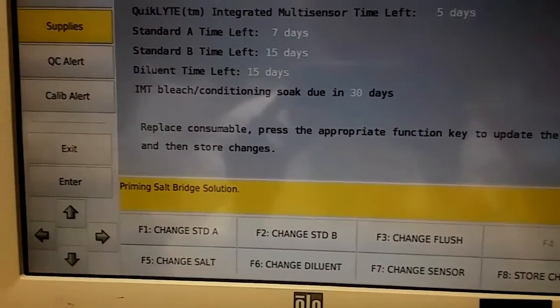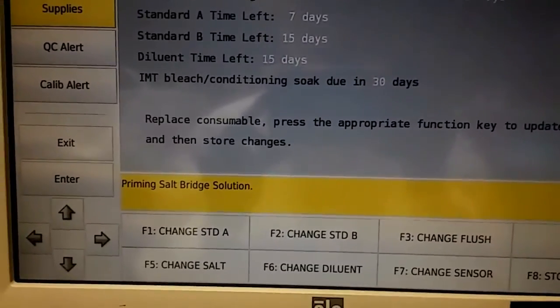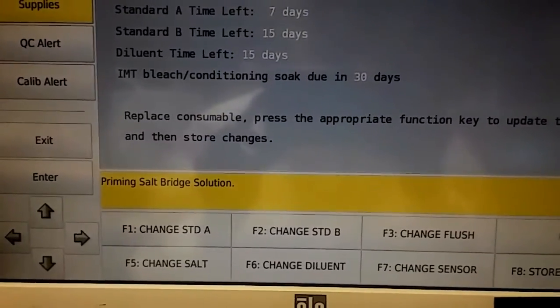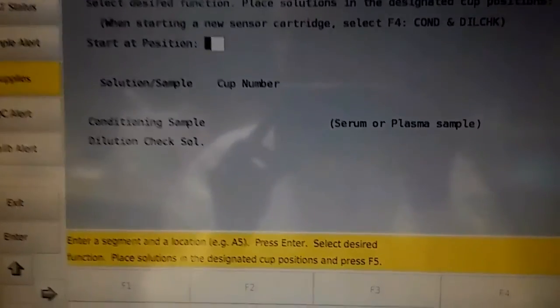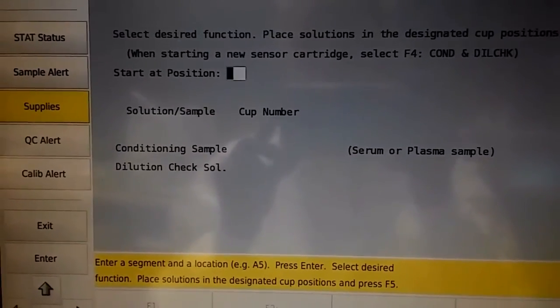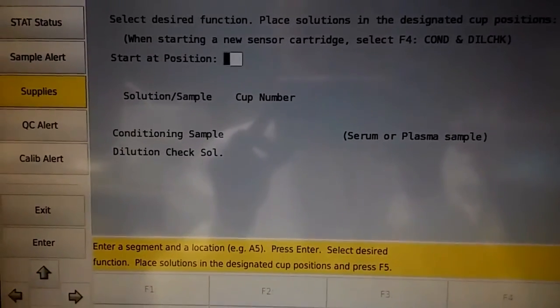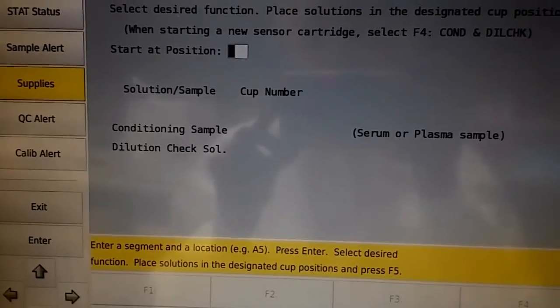Now that the changes have been stored, it'll prime the salt bridge solution — that just takes a few seconds — and then it'll ask for your patient plasma and your dill check. You want to set what position you start with, which cup, and whether you're doing just the dill check or the conditioning sample. You want to do both at first. If the dill check doesn't pass, then you can rerun just the dill check instead of the conditioning sample again.